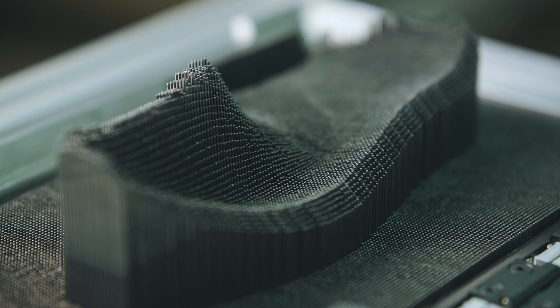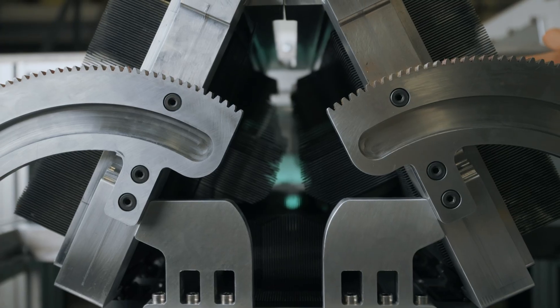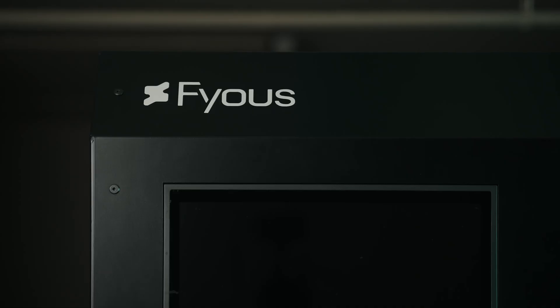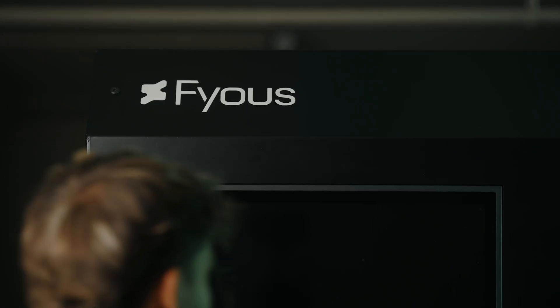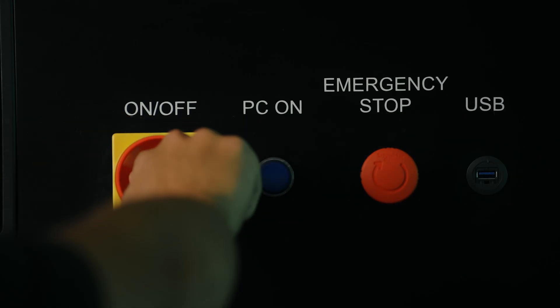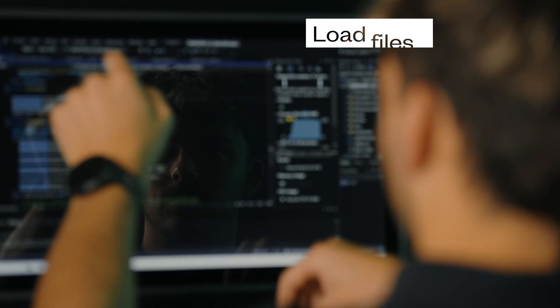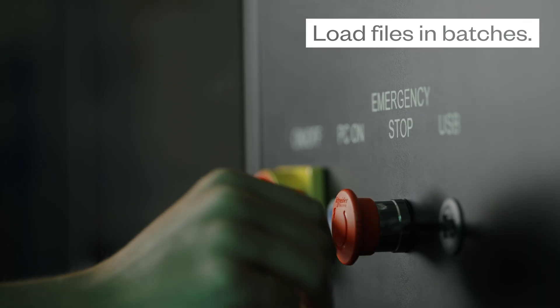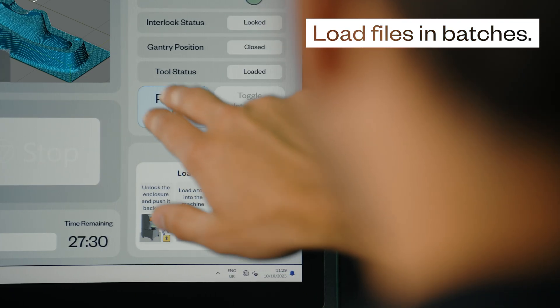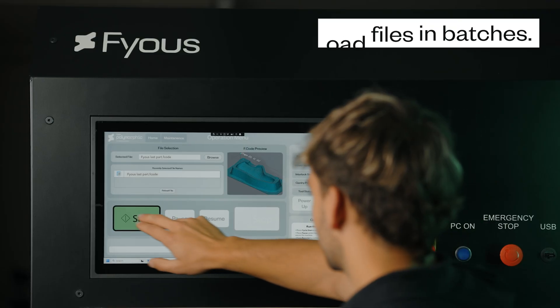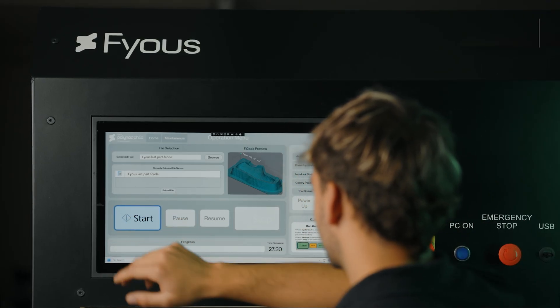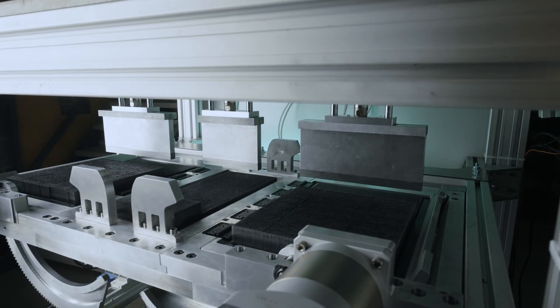For decades, custom and orthotic footwear manufacturing has been held back by inefficient technology. With Fyous' radical new solution, you can batch load STL files and enjoy days of hands-free last production.